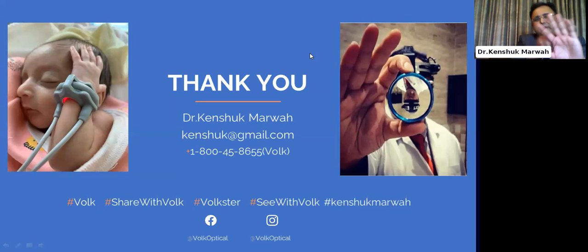Keep these three fingers on the headrest, and then move your hand. That actually helps us to maneuver while doing a slit lamp examination on a 90D or say a 78 diopter lens. So I would suggest lower magnification rather than going for a higher magnification.